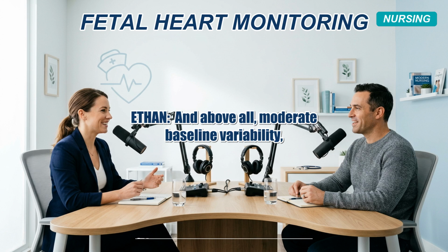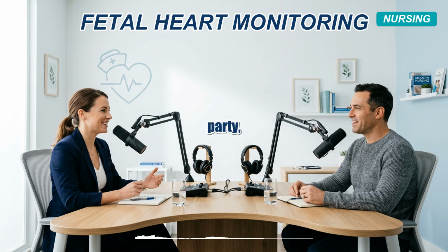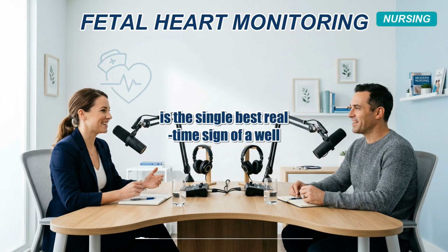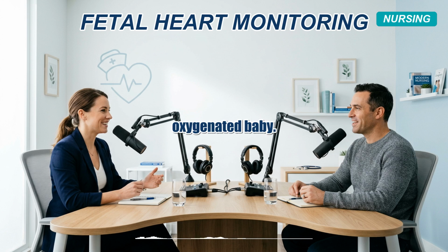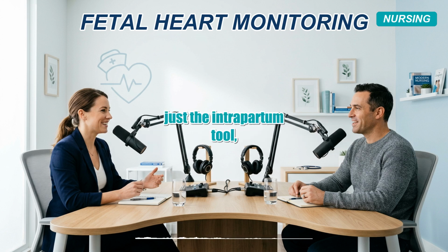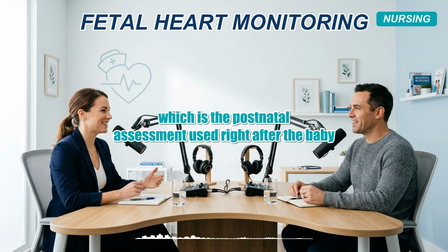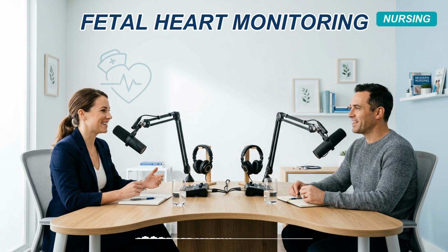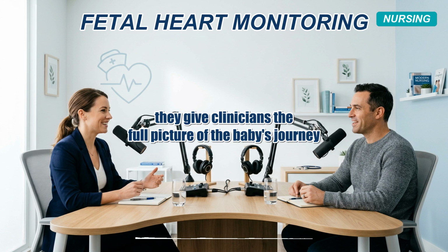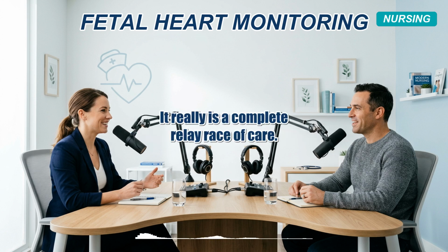And above all, moderate baseline variability, that lively, wiggly line that looks like a great dinner party, is the single best real-time sign of a well-oxygenated baby. And you know, it is always worth remembering that fetal heart monitoring is just the intrapartum tool, the tool used during birth. It pairs beautifully with Virginia Apgar's 1952 Apgar score, which is the postnatal assessment used right after the baby is born. Together, they give clinicians the full picture of the baby's journey into the world. It really is a complete relay race of care.